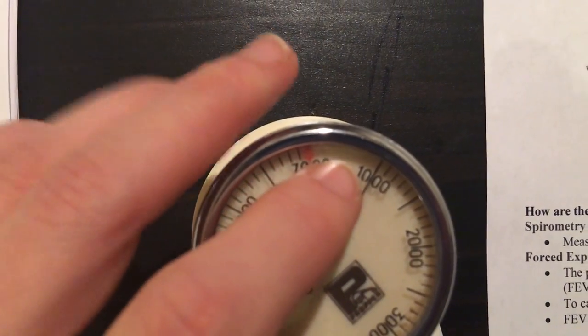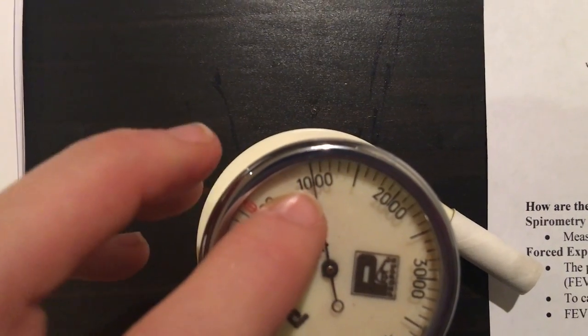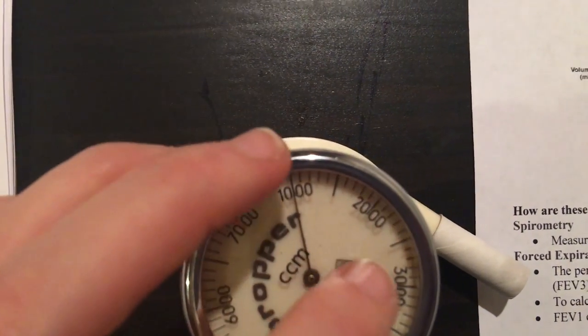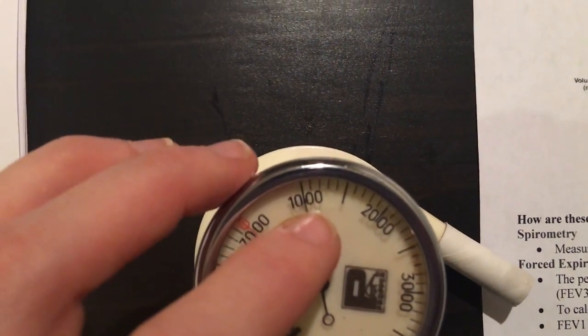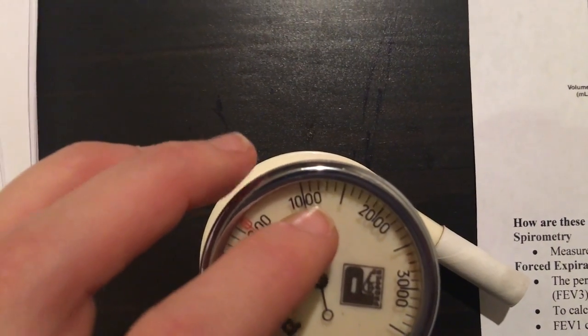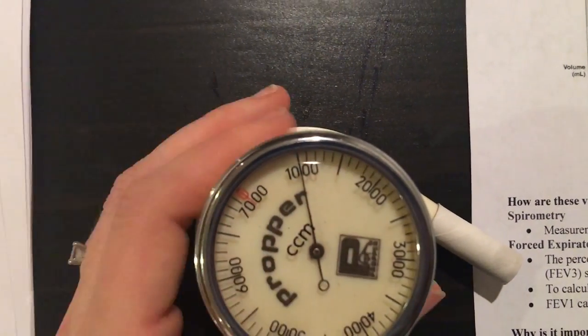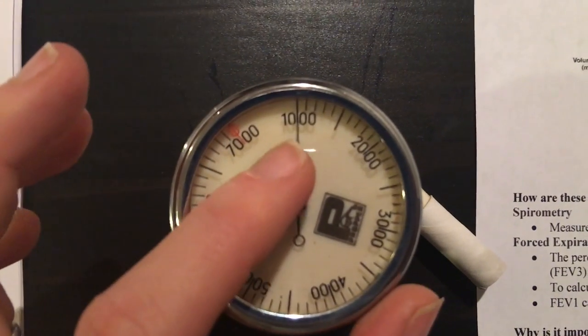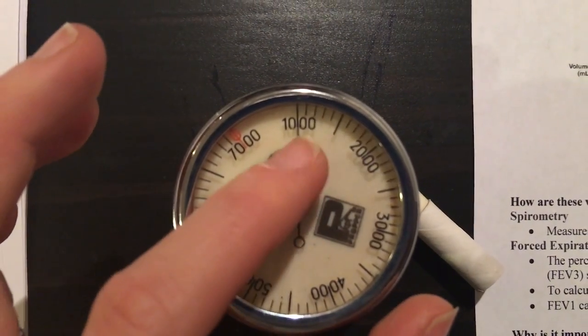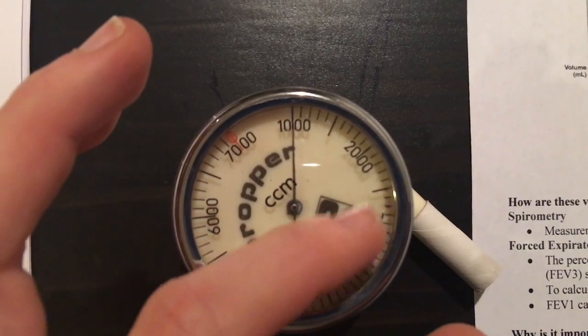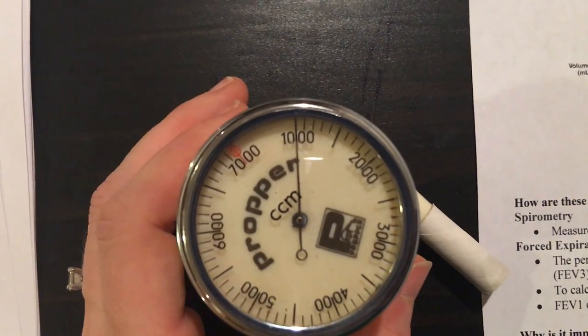When you breathe out, it will measure the volume in milliliters starting at 1000, 2000, 3000, which you can also convert to liters: one liter, two liters, three liters, four liters. It kind of looks like the face of a watch, and this hand will move around depending on the volume of air that you push through the spirometer.